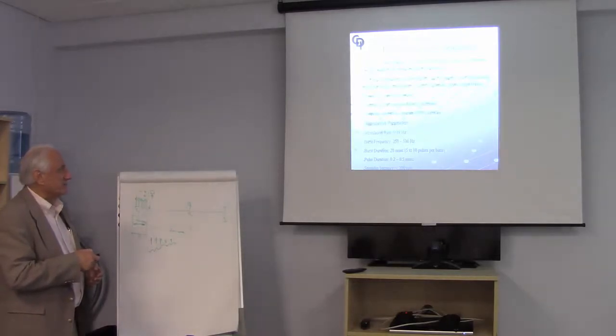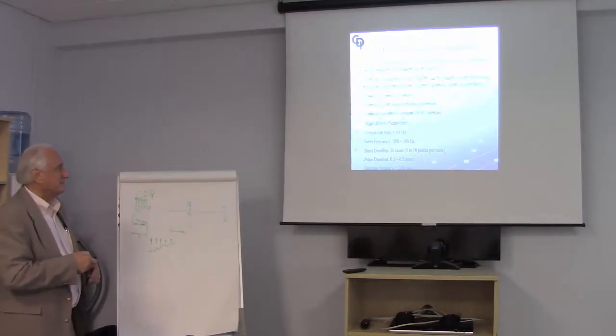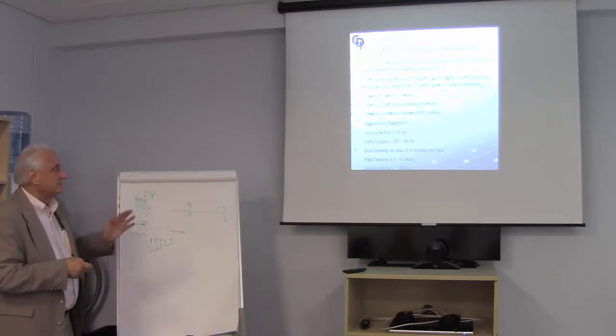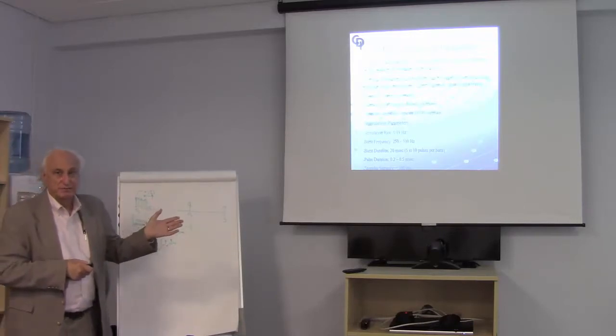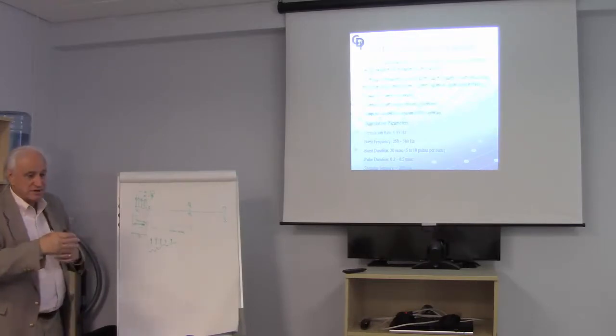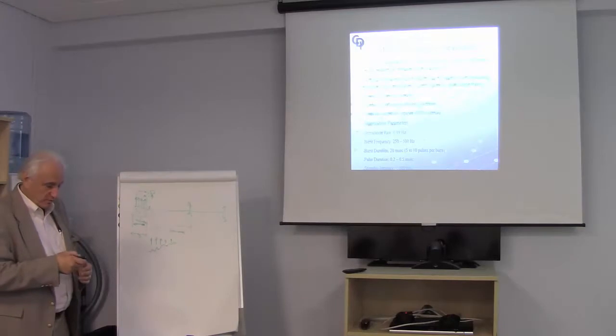I make this point over and over again. Hopefully everybody's sick of hearing it. Synapses are important. Okay. The stimulation parameters to get around the effects of anesthesia are short duration multi-pulse trains, which we call bursts. This idea was developed originally by a physiologist named Amassian, who worked in the late 50s, early 60s. He did a lot of studying of the motor pathways and figured that if you use this kind of bursting pattern, you could drive them quite well.